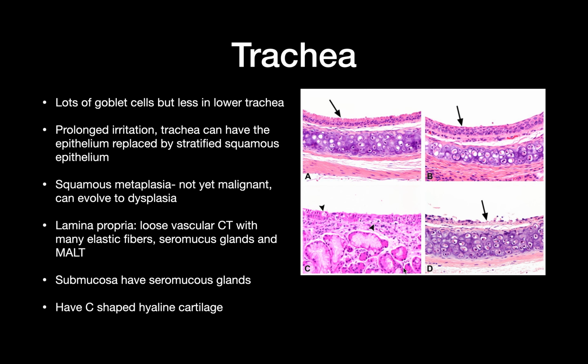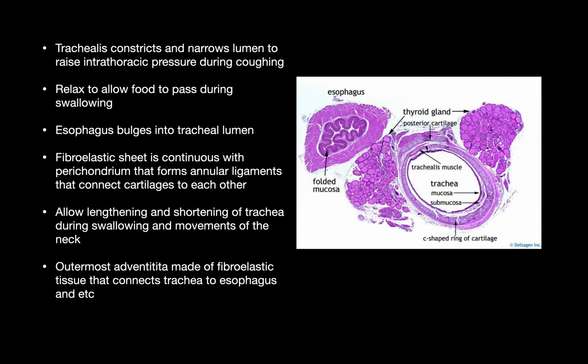So here's the glands, here's the cartilage, and the cartilage is there to provide shape, but in the back it's open, so the bolus of food passing down the esophagus can stretch and not disrupt the trachea too much, but it will also compress it. So sometimes when you take too big of a mouthful of water or food, you can feel kind of breathless, and it's literally because your trachea is closing off.